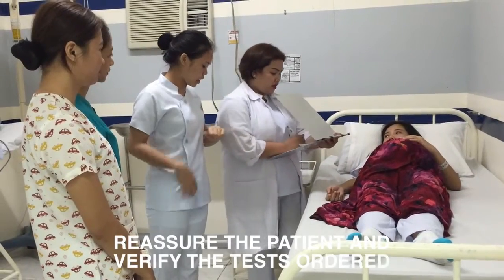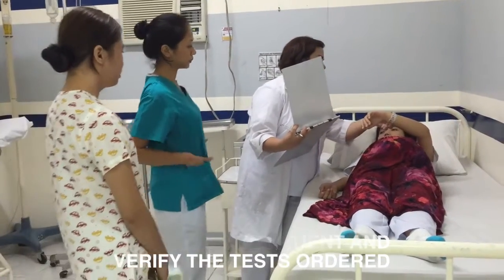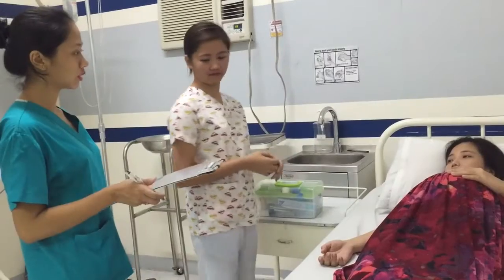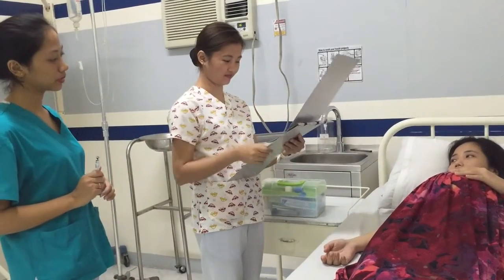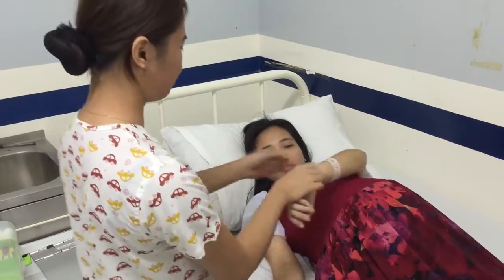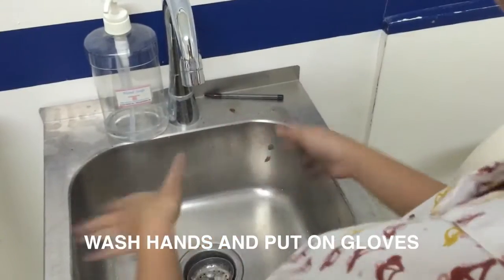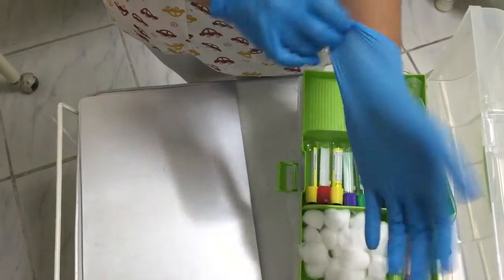Reassure the patient — as the medical technologist, you must act confident, educated, and experienced.